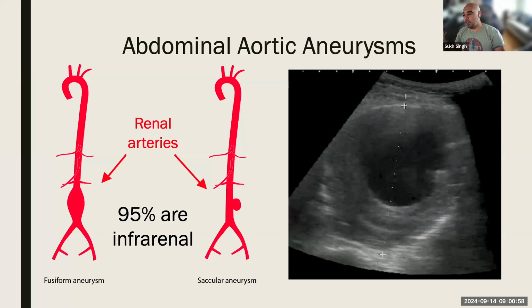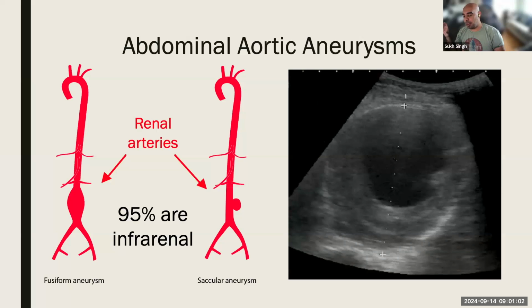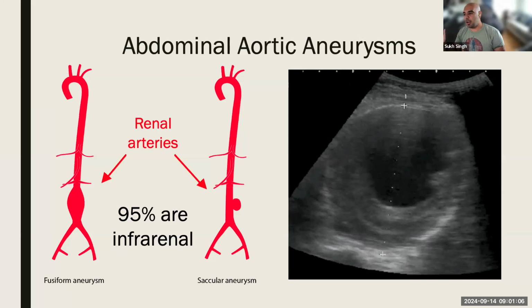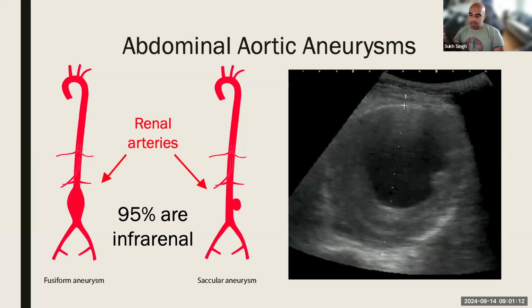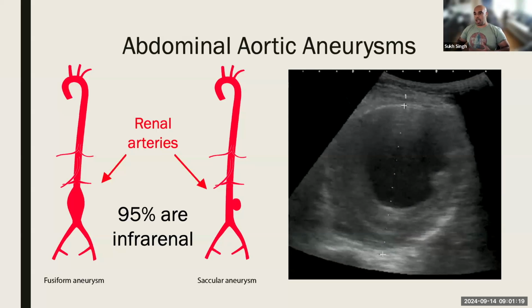And so your goal should be at the end of your session to make sure you understand all these topics. I know this is a lot of information in the video, but once you have this, 2 hours of hands-on to reemphasize this scan, I think it's going to really congeal it together. But go over your gain, your depth, talk about your artifacts, ask your faculty, and then all you're really responsible for today is just scanning the abdominal aorta, just this much.